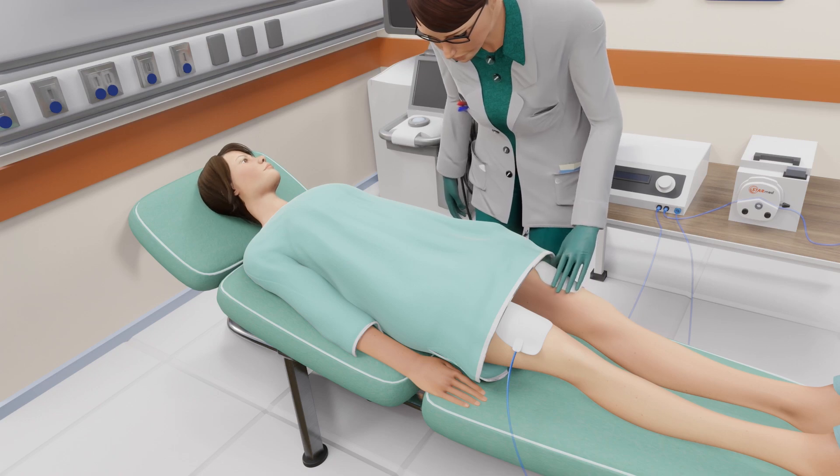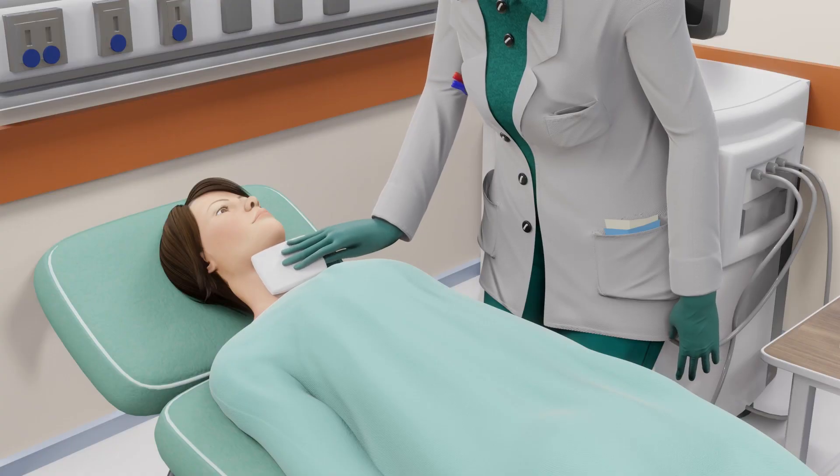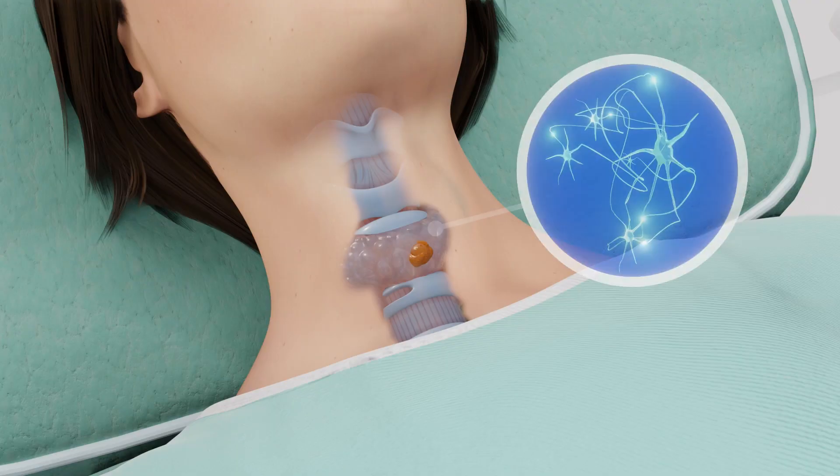Two grounding pads will be placed on your thighs. Your thighs may be shaved if necessary. Your neck will then be cleaned and disinfected to avoid infection. The thyroid capsule has sensory nerves that can feel pain.